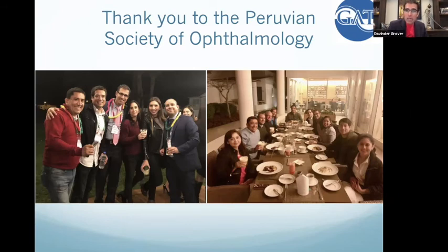I would say early on, when you're first learning it, it may be easier to do the GATT first because then you have the best view. If you do FACO and then GATT, and you hydrate your wound a little bit or get a little corneal edema, it can make your view of the angle more difficult.